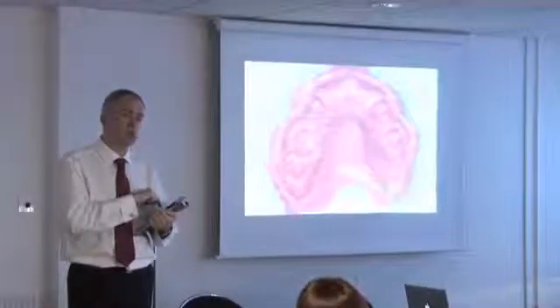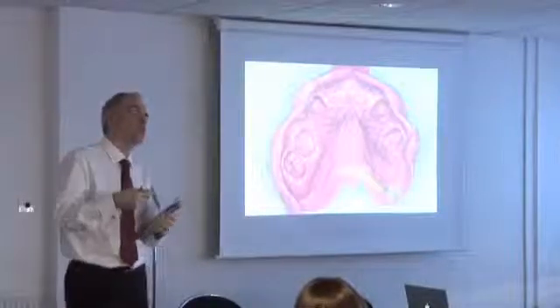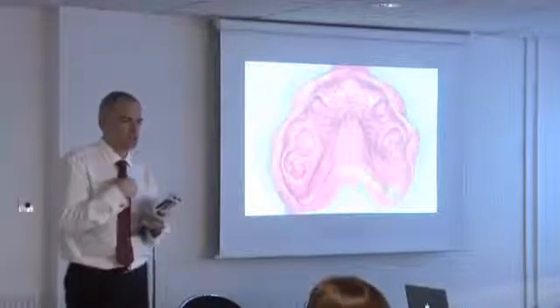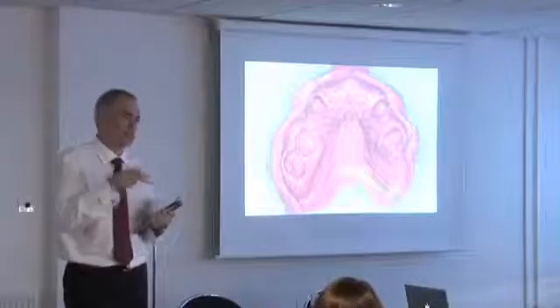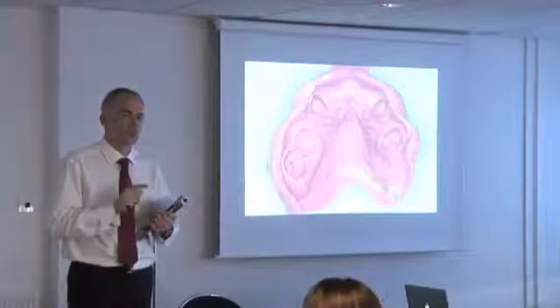Now I'll take my impression, my working impression for the chrome. I know books and courses will tell you that you should be fitting everything at the same time, the chrome and the crowns. Personally, I find that there's a potential to lose control at that point. I like to know things are fitting a little bit ahead of time, rather than everything coming as a surprise at the end. Christmas comes but once a year.